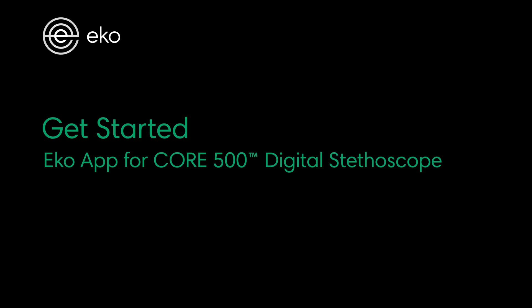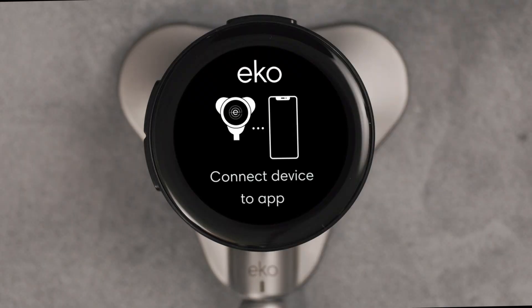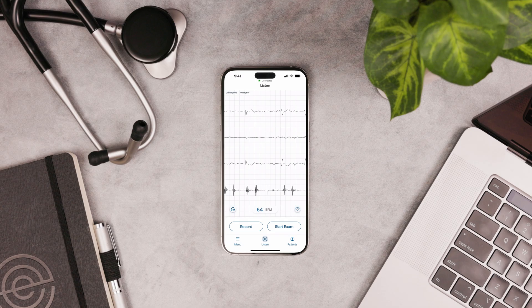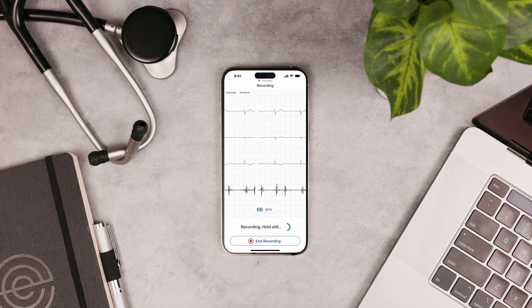Hey there. In this video tutorial we're going to show you how to get started with the Echo app. You'll need to use the app to finish setting up your Core 500. The app is required to take recordings with the Core 500 and view AI results on the device's screen. You'll also need it to visualize the 3-lead ECG.